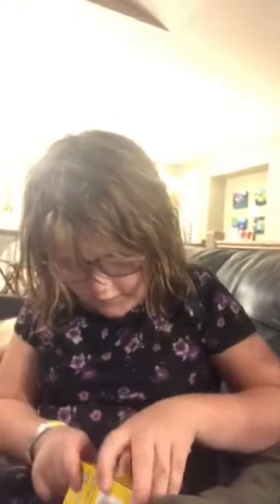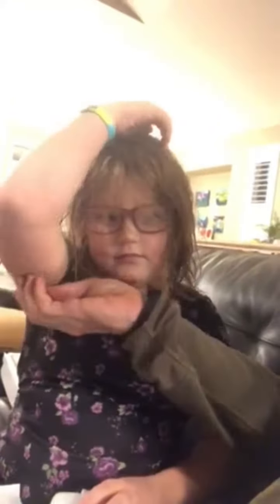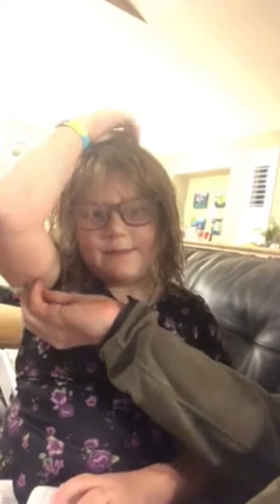Pull there to open the box. Pull it open. Is there an instruction in there for it? Yeah. Put it here, all around — just like a big spot.